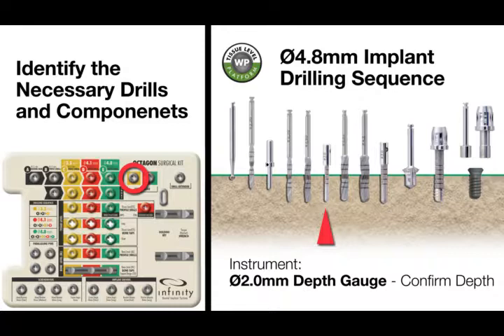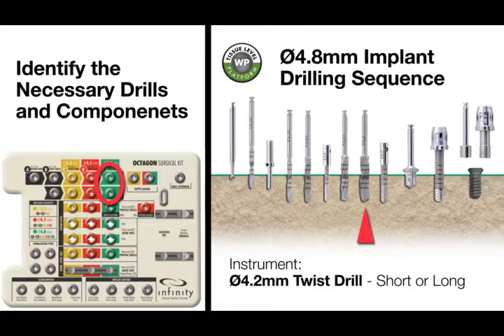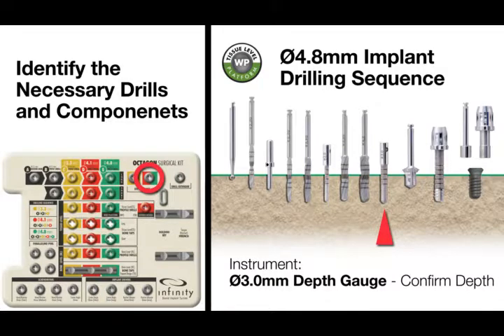This depth gauge can be found in the top right area of the surgical tray, marked in yellow. Sixth, choose either the short or long 3.5 mm diameter twist drill from column D, marked in red on the surgical tray. Seventh, choose either the short or long 4.2 mm diameter twist drill from column E, marked in green on the surgical tray. Eighth, choose the 3 mm diameter depth gauge. This depth gauge can be found in the top right area of the surgical tray, marked red and green.